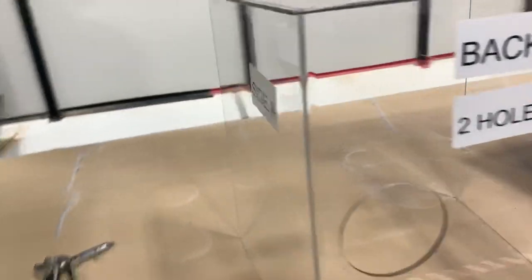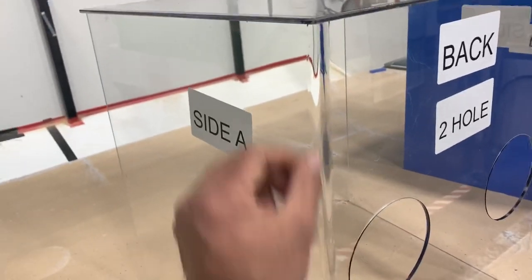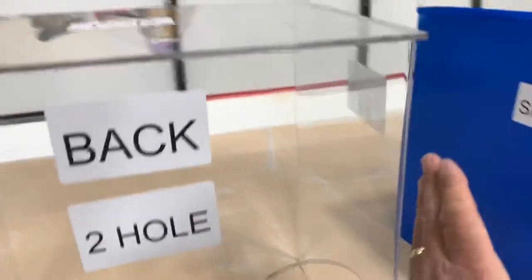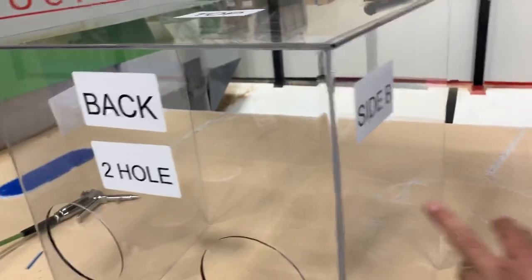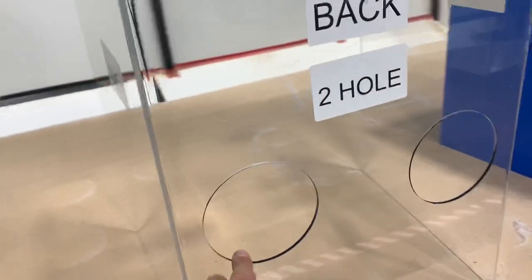Here's what it is: it is one single piece of acrylic plexiglass that's been heat-bent in the corners for three sides — Side B, the back, and Side A — that's all one continuous piece.